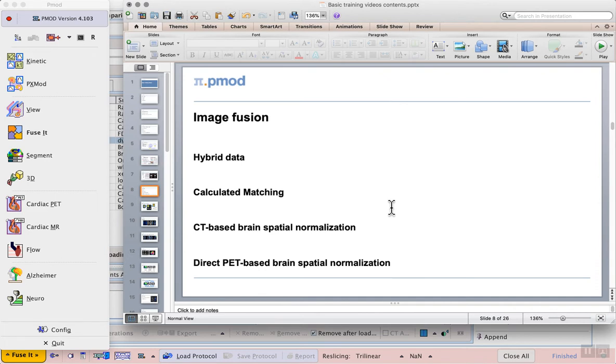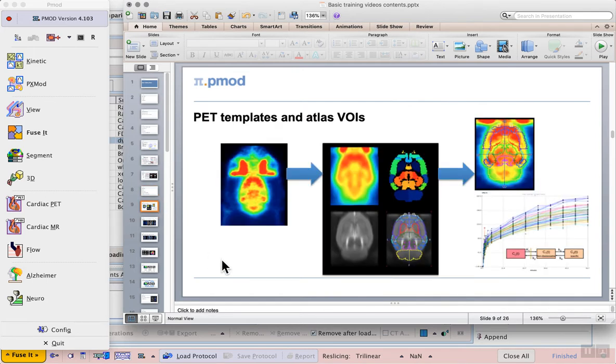In this video we continue with image fusion, now moving on to direct PET-based brain spatial normalization. With an appropriate distribution of the tracer and the right templates, direct matching of brain PET data to a PET template is possible. This is also a solution for the many standalone PET scanners still in use around the world.